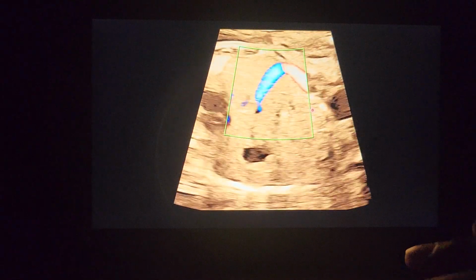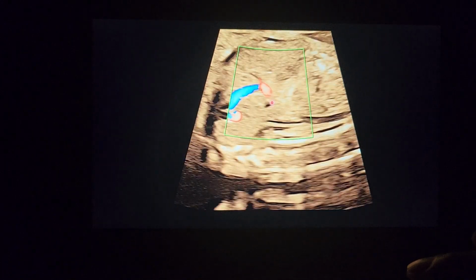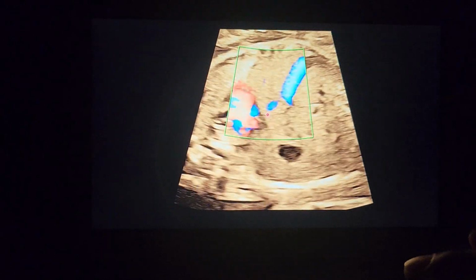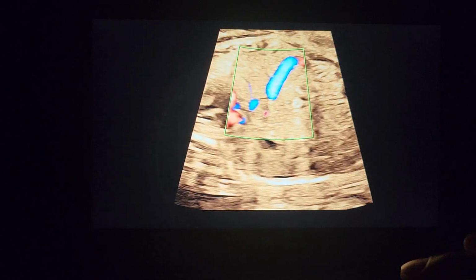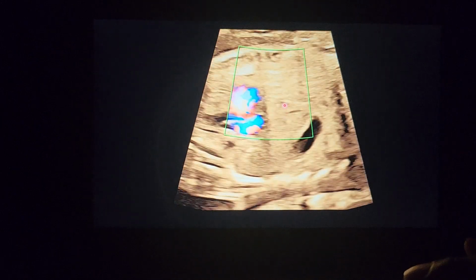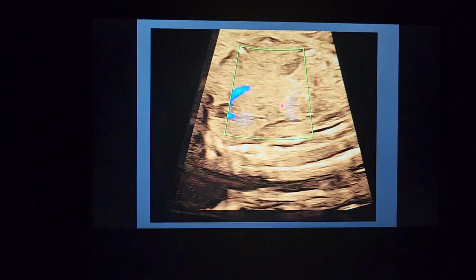So here you can see that umbilical vein enters the abdomen, goes to the liver, goes towards portal sinus, but blindly ends into portal sinus. It does not communicate with the IVC at all. So that is the clue which you have to pick up. This small bit of aliased portion of the vein which we learnt as ductus venosus is absent in this case. So the umbilical vein goes into portal sinus and takes all the blood into portal veins, and the hepatic vein goes into IVC, and the junction is not visible.